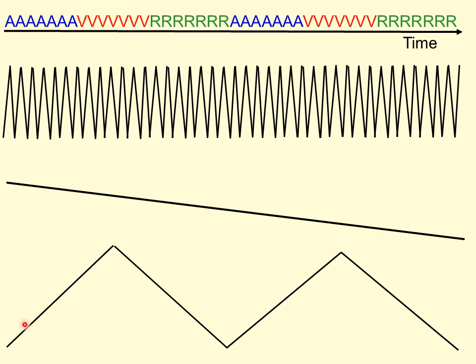And this shape here represents the frequency of the signals that would be related to visual stimulation in the experiment. So what we want to do with our temporal filtering is to definitely remove these low frequency drifts from the data, and we'll discuss the issues surrounding trying to remove these high frequency signals from the data as well.